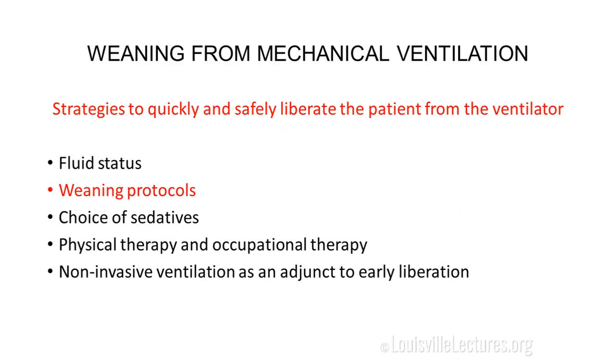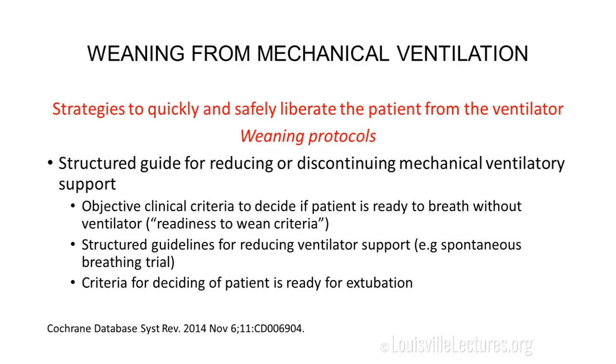So another strategy to get your patient off the ventilator quickly and safely is a weaning protocol. Like I said, we are not very good predictors of whether a patient is ready to be extubated or not, just based on clinical judgment. So it's better to use a protocol and do that in a systematic way. So what is a weaning protocol? It's a structured guide for reducing or discontinuing mechanical ventilatory support. So you have objective clinical criteria to decide if the patient is ready to breathe without the ventilator.